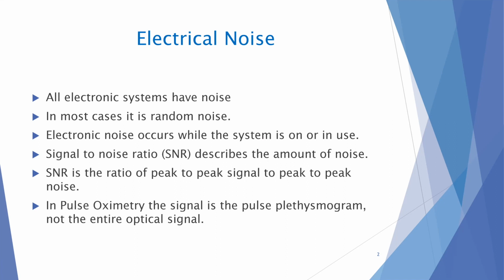I'm sorry, I meant at low perfusion for the Masimo light skin graph shows a very similar negative bias, kind of the mirror image of the black skin result, it seems like. Yes, you are correct. But the magnitude of that effect, as I said, is small. The graphs indicate it's about the same, is it not? The precision difference too.